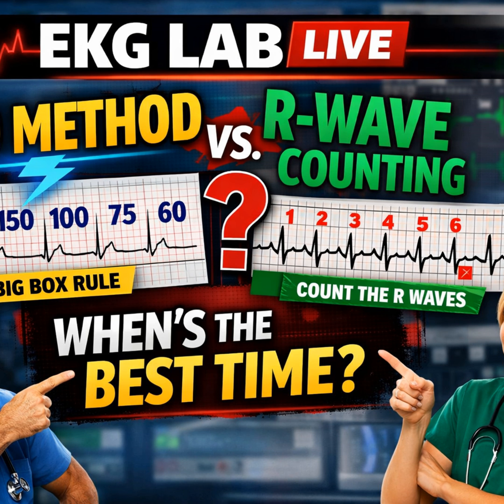Let's look at atrial flutter. The UNC source describes that classic sawtooth pattern. It's a macro reentrance circuit. The atrium is beating at almost exactly 300 beats per minute. A fast loop, yeah. It's a machine, and the AV node usually blocks this in a set ratio, 2-to-1, 3-to-1, 4-to-1. If there's a 2-to-1 block, the ventricular rate is 150, exactly 150, not about 140, not fast, 150.